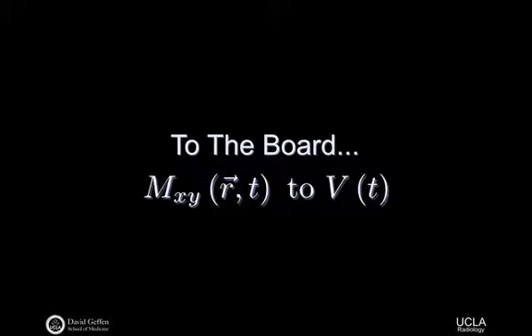And then the last one is if we look at what happens to our Mz magnetization, right? So the partial of Mz as a function of time is just equal to zero because it's a constant, right? And so that gives us a little bit of insight as to what's going on. These first two terms here, right? These are a consequence of free precession. That's the first thing. And these are also large in some sense.